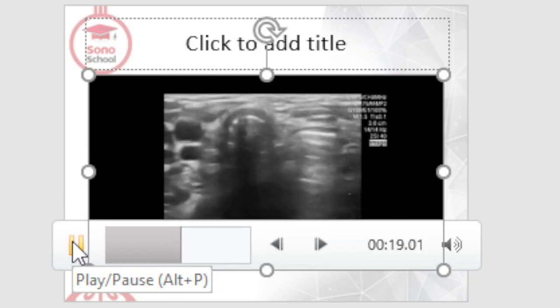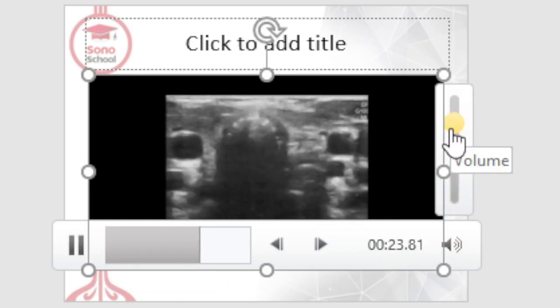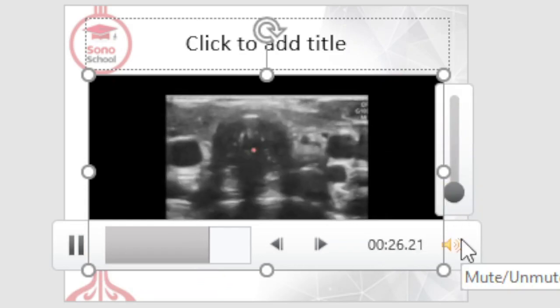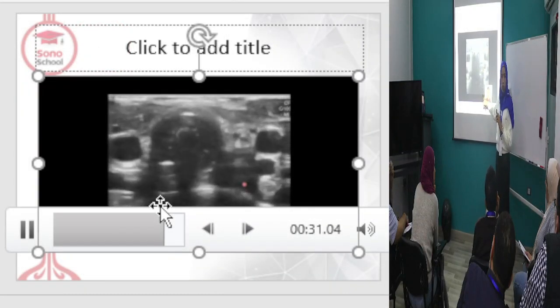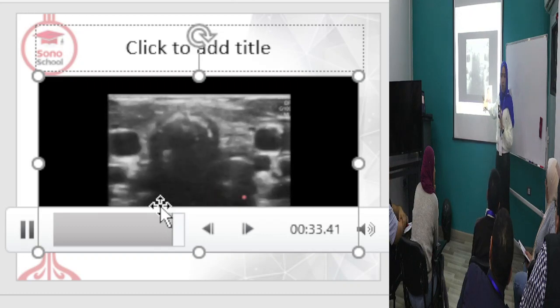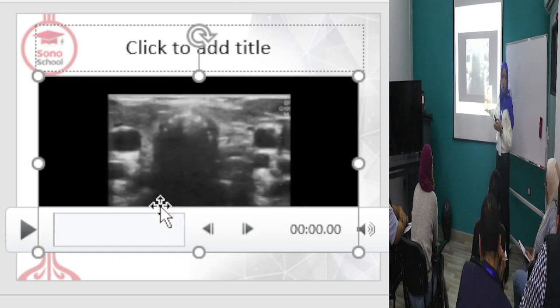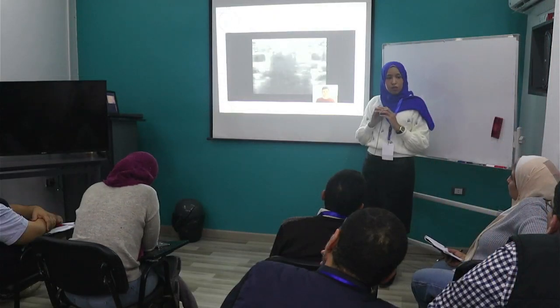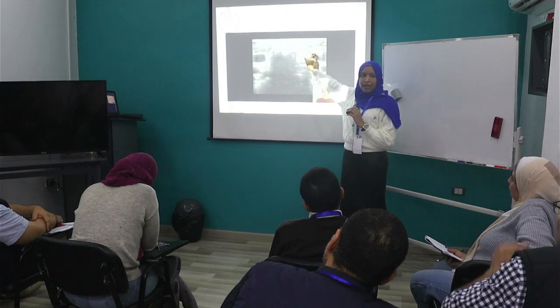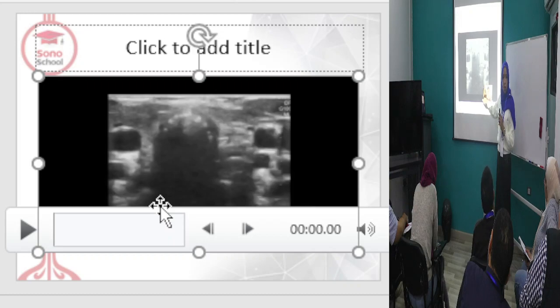To the left. Now, as in this video, there is a false endotracheal tube placed in the esophagus. Assuming this is not appearing right here, this air column is in the wrong position, instead of being here at the site of the trachea rings. So if you see an air column with reverberation artifact, this is the wrong place.